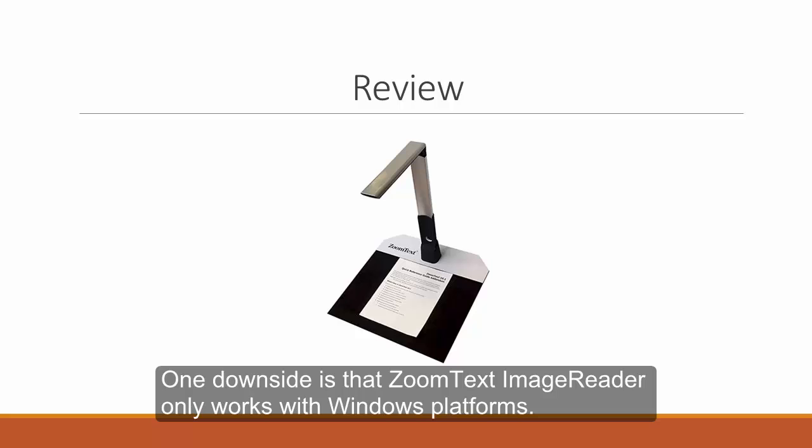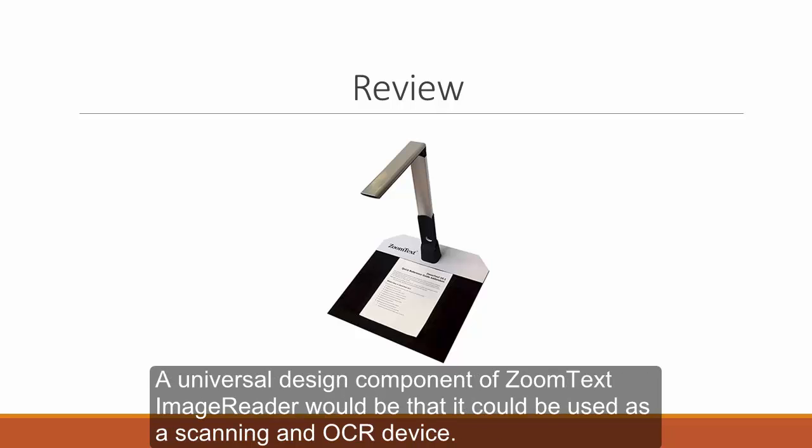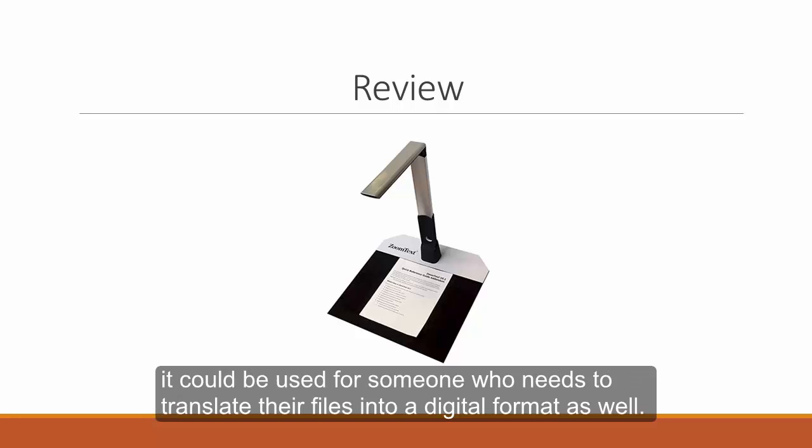One downside is that Zoom Text Image Reader only works with Windows platforms. They are removing a large portion of clients who use Macs, especially since Macs are known to have many accessibility features. A universal design component of ZoomText ImageReader would be that it could be used as a scanning and OCR device. While it was created for users who are low vision or blind, it could be used for someone who needs to translate their files into a digital format as well.